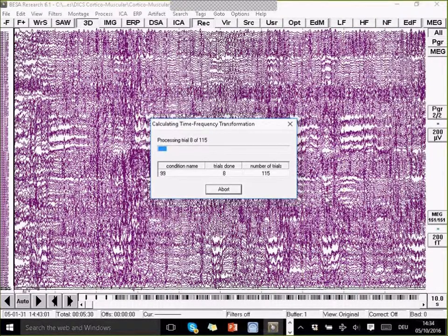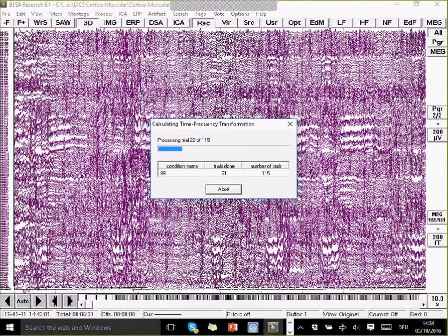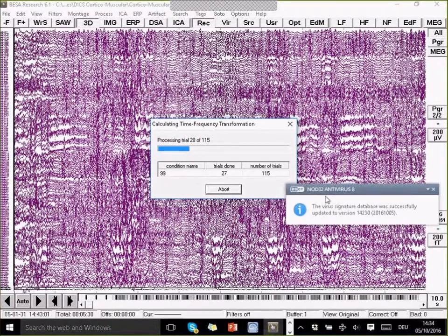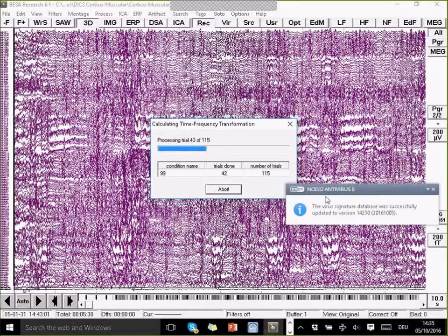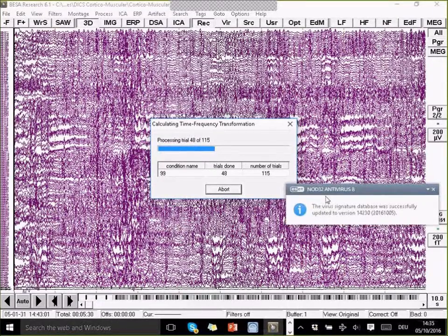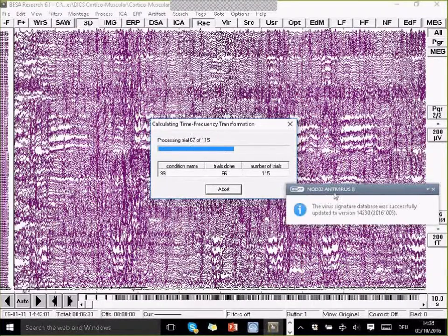We can now compute the time-frequency decomposition of this, where we actually only care about the frequency, and then we will calculate the DICS between the cortical activation and the muscular activation.